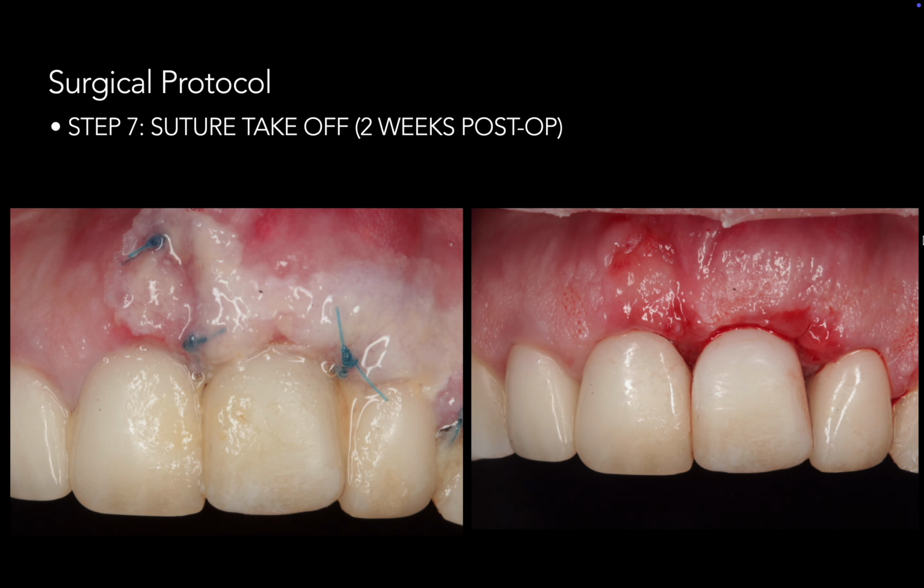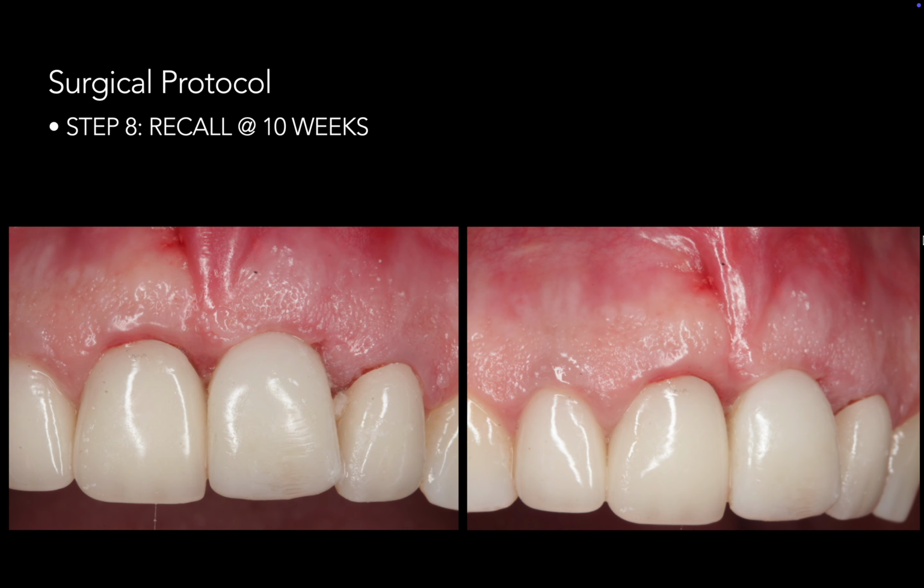Now at 2 weeks post-op, my patient came back for the suture takeoff appointment. As you can see, there was a dressing that was placed there, and my dressing of choice is periacryl. So immediately upon removing the dressing as well as the sutures, this was how the tissues looked, and I was quite happy with how they looked, as they looked like they were maturing quite well. Now at 10 weeks, this was how the tissues looked, and they looked even better, so I knew that we were on the right track.